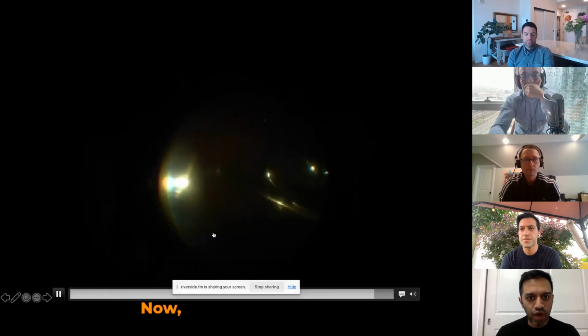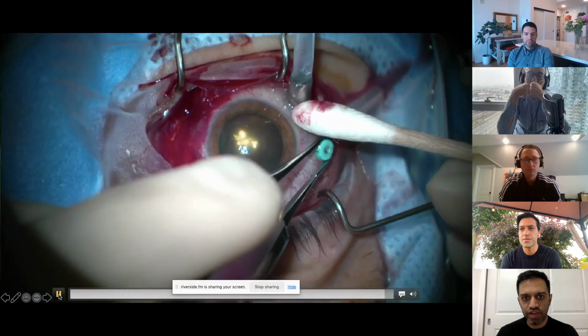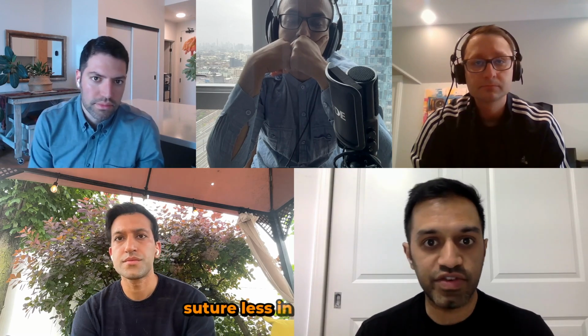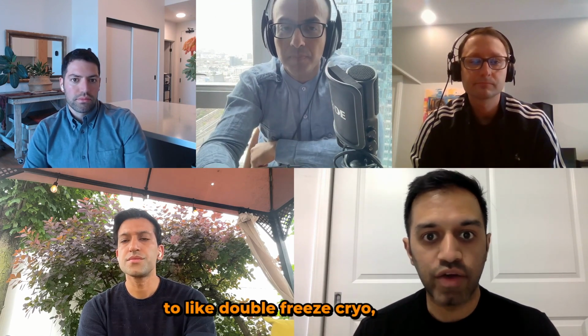Now, when you're closing up, there's sometimes the question of, do you suture these or not? Is it okay to do unsutured? I think it's perfectly fine to do sutureless in these cases. This is not like retinoblastoma or choroidal melanoma, perhaps, where you want to double freeze cryo your sclerotomy sites.